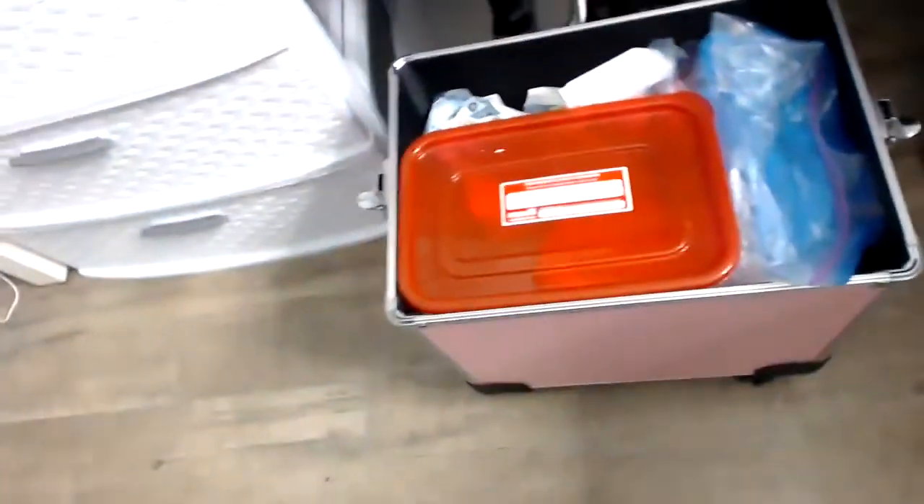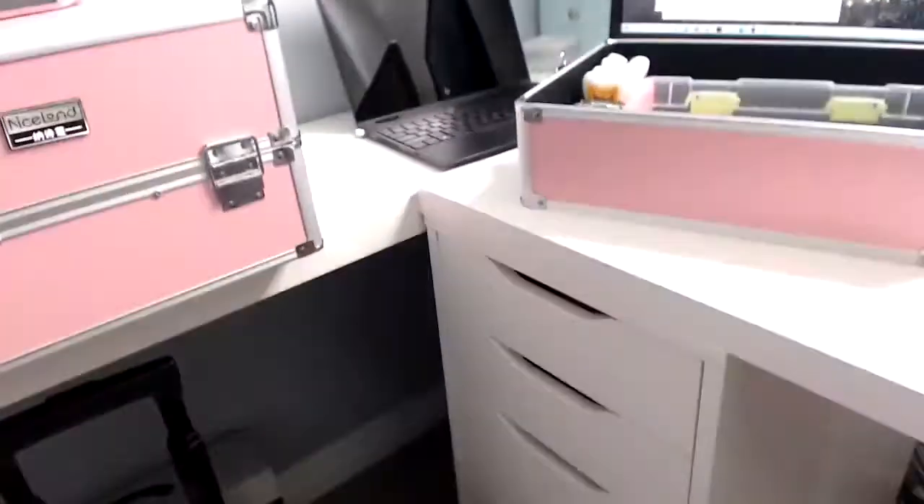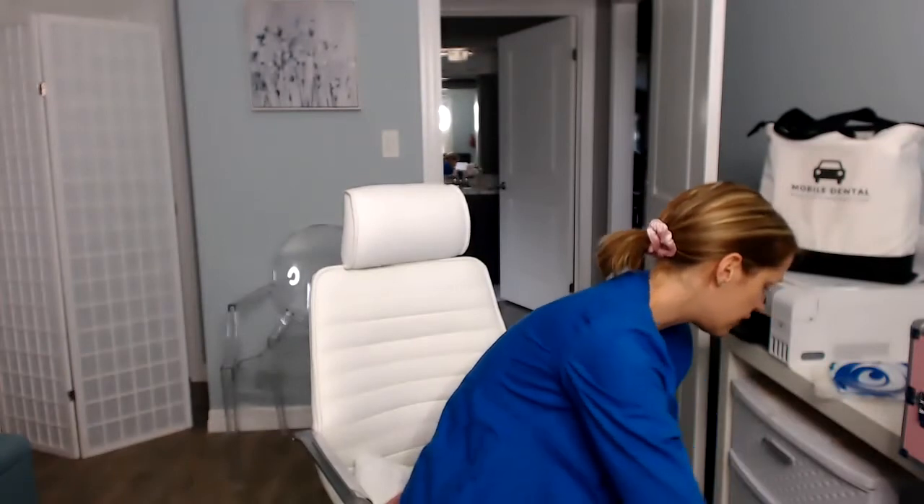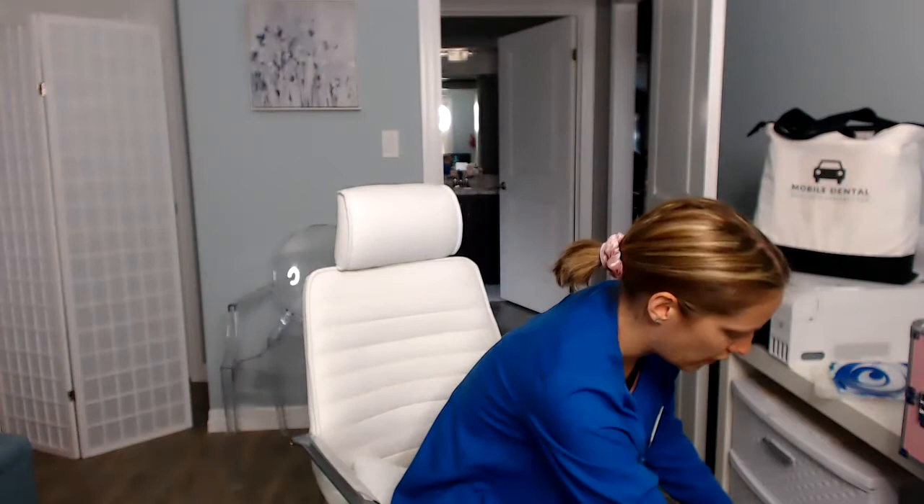Doesn't this just make you excited to start cleaning teeth? It makes me excited. All of those little compartments are so amazing. I'm going to leave the link to the cart for you guys. The best money I've spent — I want to say around $200 for it, the pink one. The pink one was actually less expensive than the black one, so I got the pink one, and the pink makes me happy. I'm really glad I got it.